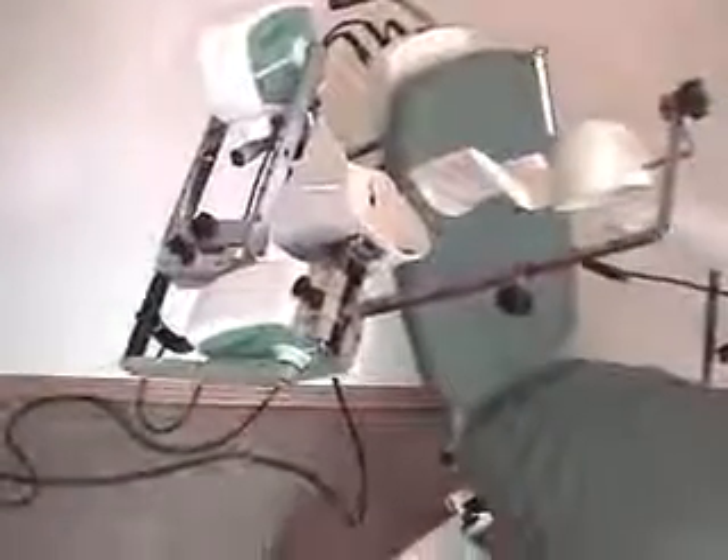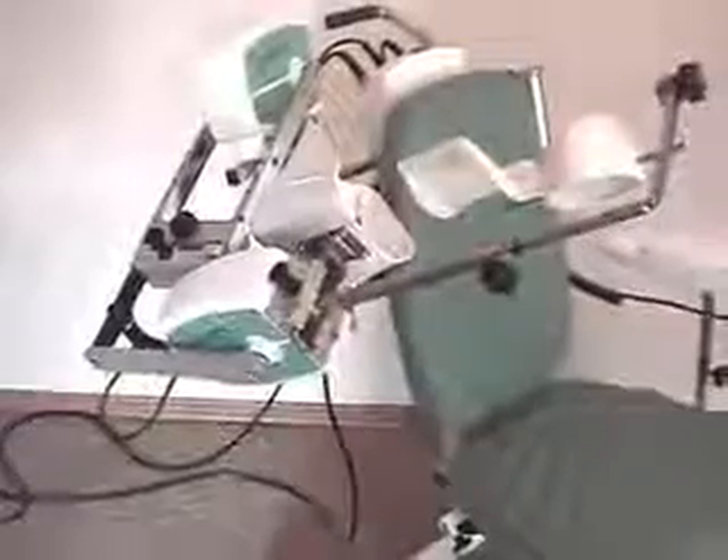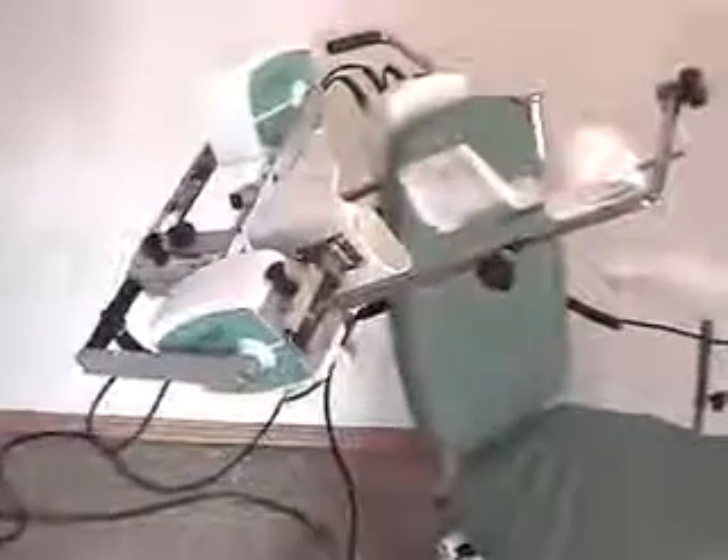M2 is simply along for the ride — there is no rotation occurring. You can do your abduction and adduction with your arm in any particular degree of rotation, statically, simply to get that range in abduction with your arm held at a particular point of rotation.